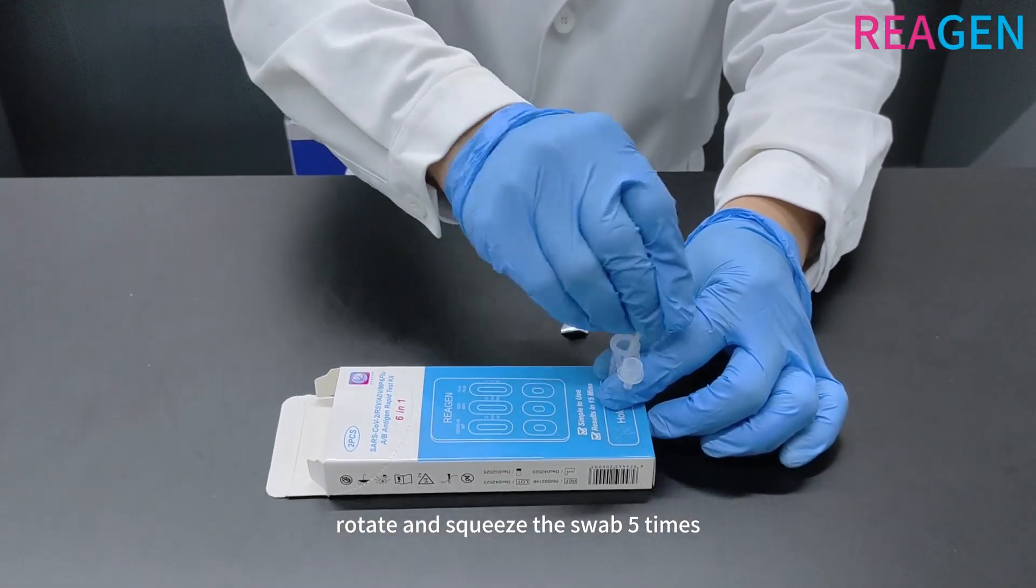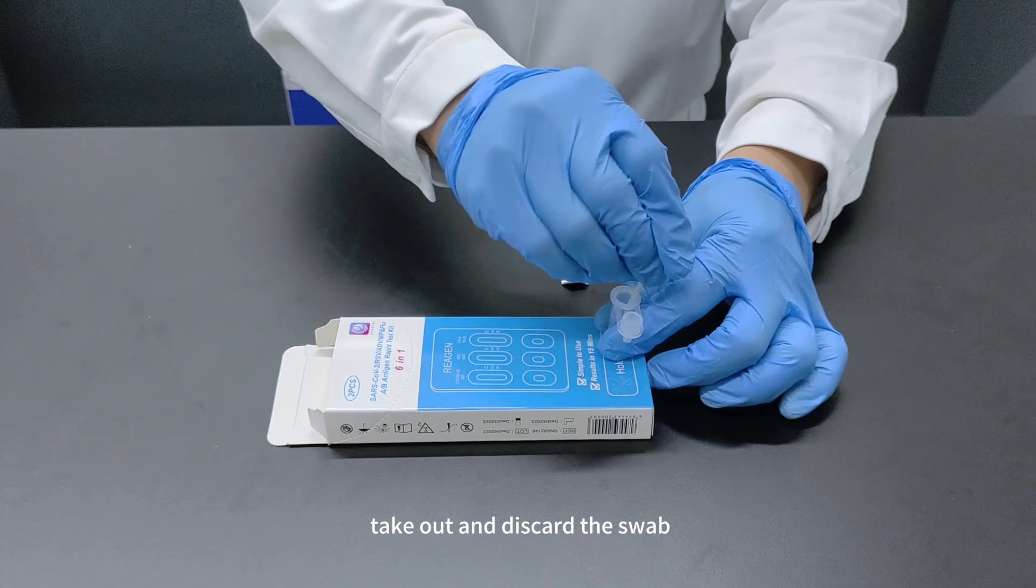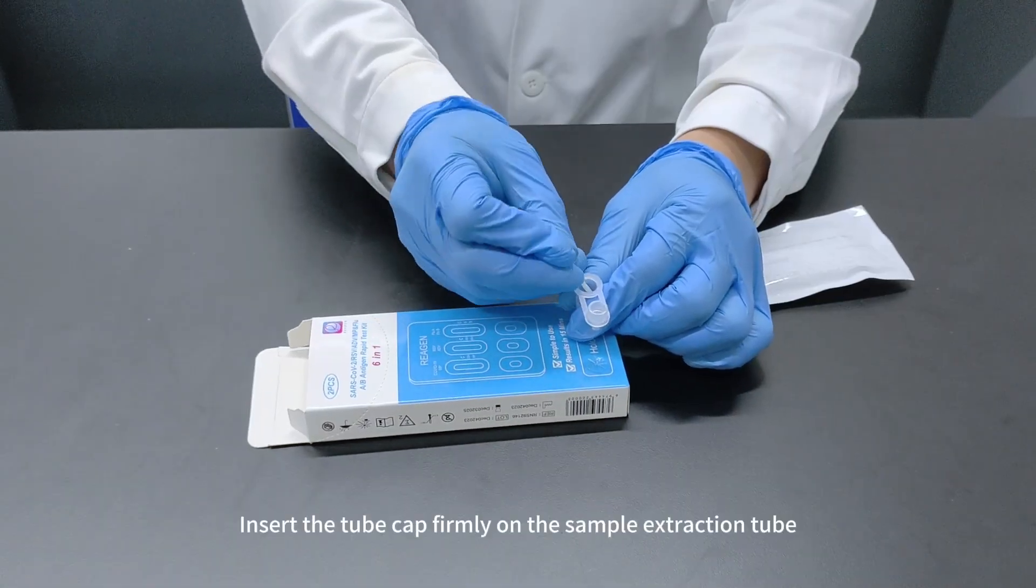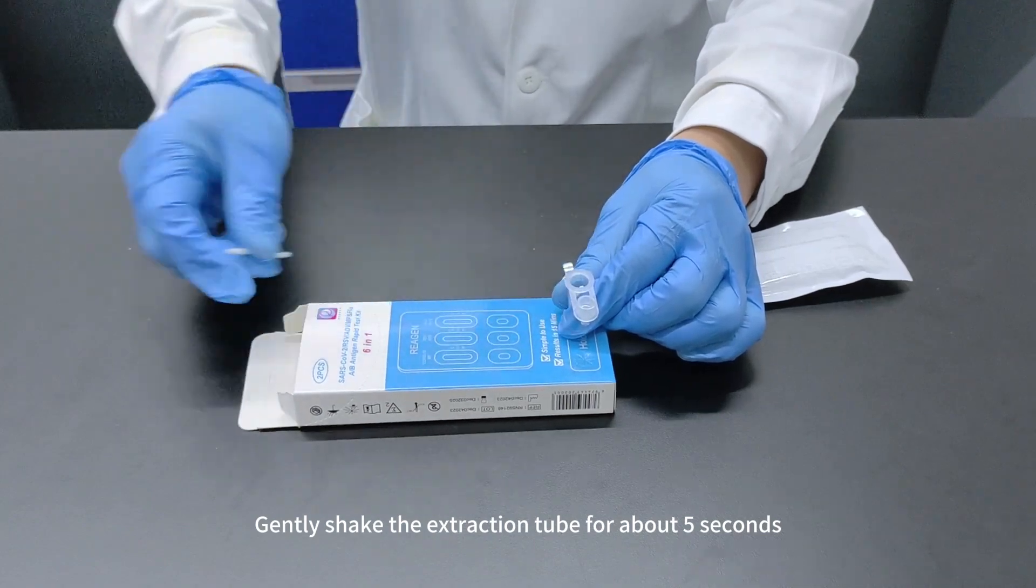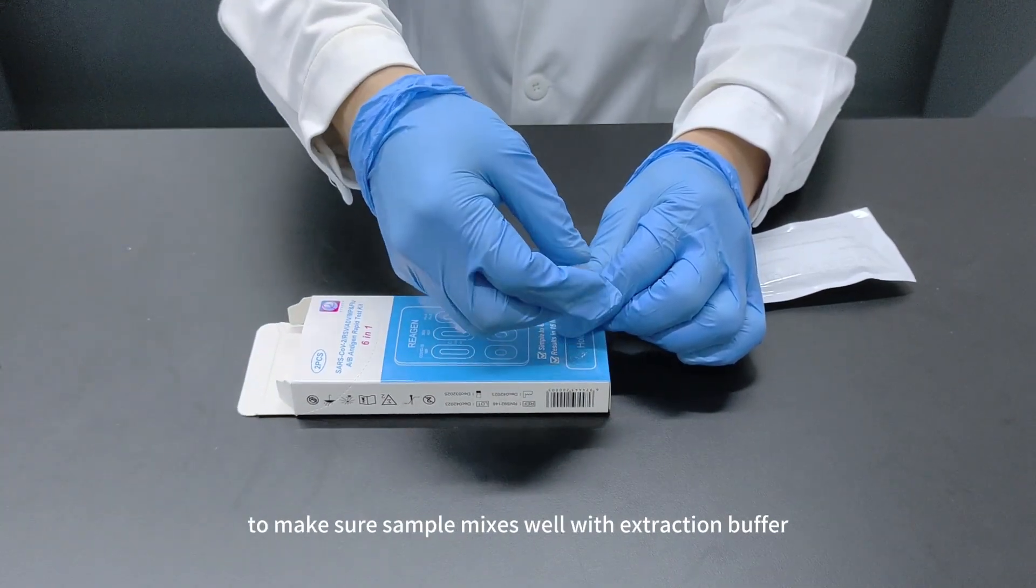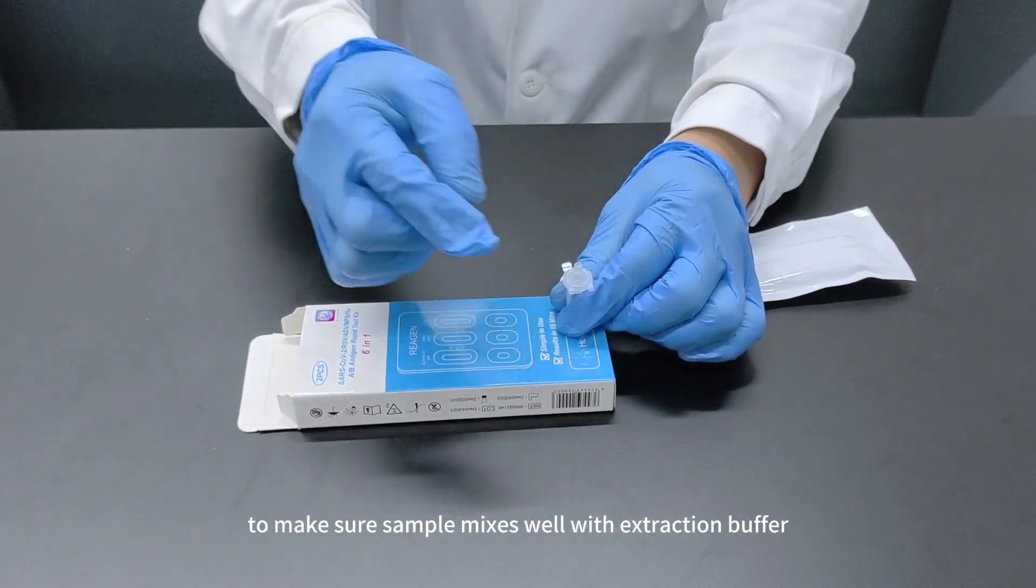Rotate and squeeze the swab five times. Take out and discard the swab. Step 3: Insert the tube cap firmly on the sample extraction tube. Gently shake the extraction tube for about five seconds to make sure sample mixes well with extraction buffer.